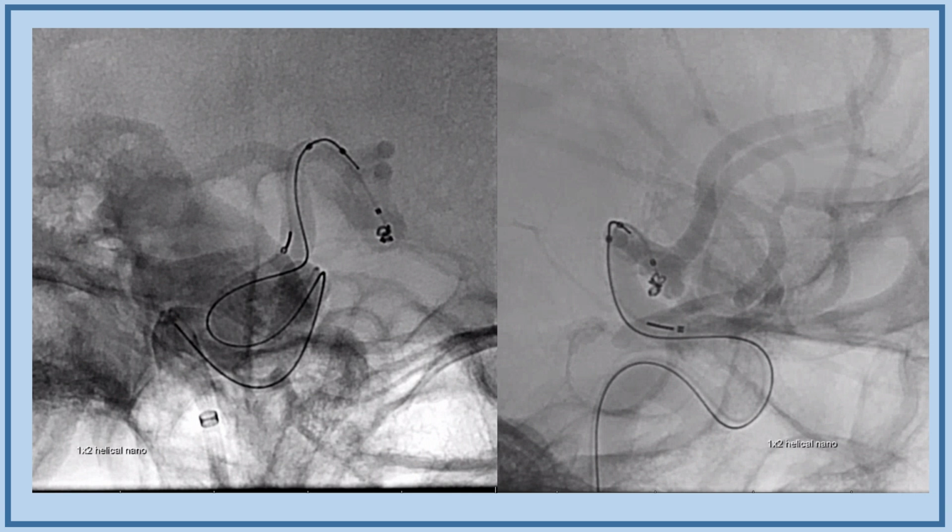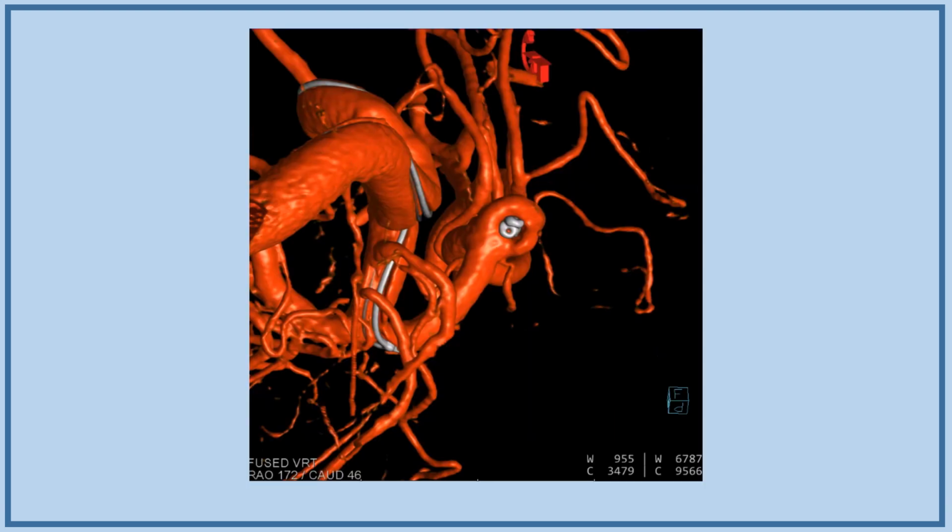We put in a 1x1, but realized it's a little bit too small, and so the 1x2 fit rather well. At this point, that's what we got. Now, we weren't gonna take too many chances with this, so what we did is a 3D with the coil in place, and you can see the coil is not detached. You can still see all the wiring running through it, so the coil is still attached, and we just want to make sure it's sitting right, which it looks to be sitting just fine.